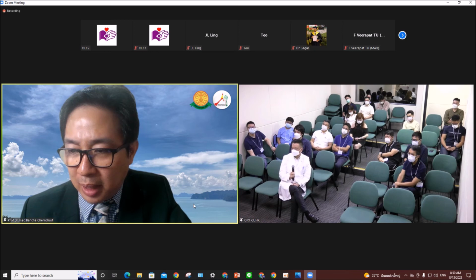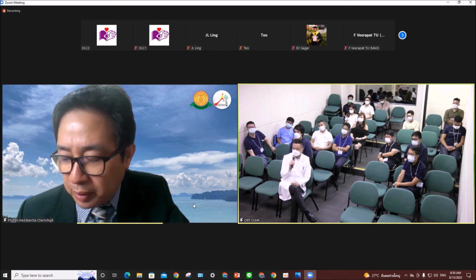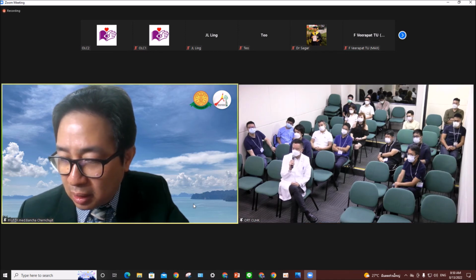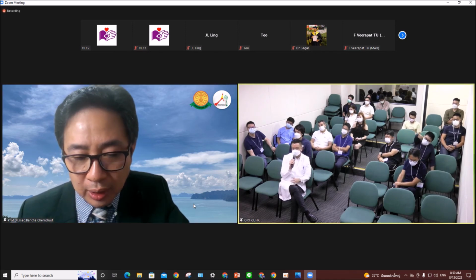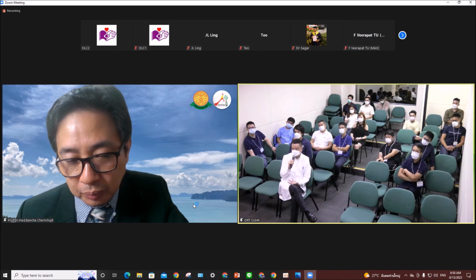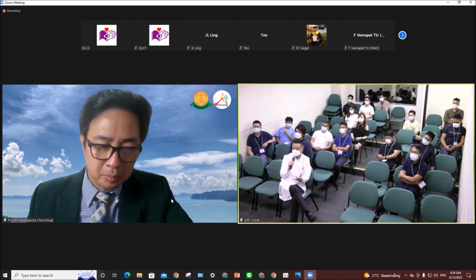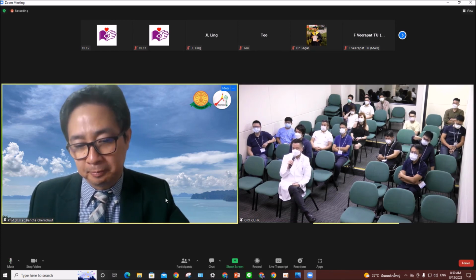May I add some bone marrow aspirate concentrate, the BMAC, to inject into this scaffold to heal nicely? I'm not sure. Patrick, what do you think? I'm not sure, right? Very much like people use PRP and so on, right? The evidence is not very strong, but I think now the trend, as I mentioned, is people like you have very good surgical technique and so on, but somehow we may not be able to overcome the biological side, right? So that's why we explore these options, right?